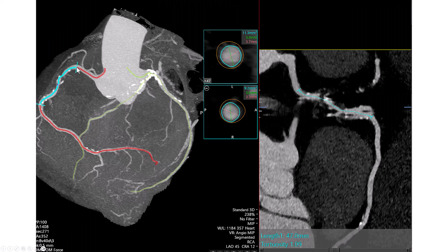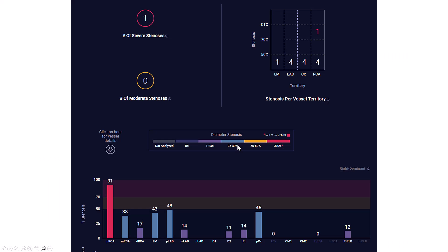When we measure the length from normal to normal, it measured at 47 mm, with a reference diameter of 3.3 mm distally and 3.7 mm more proximally. This is the ClearList system for analyzing the angiogram, which again shows severe disease in the right coronary artery.